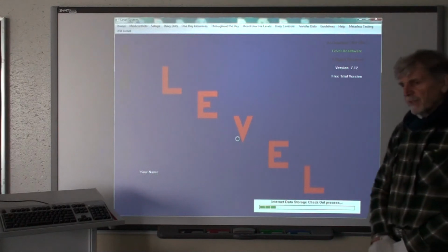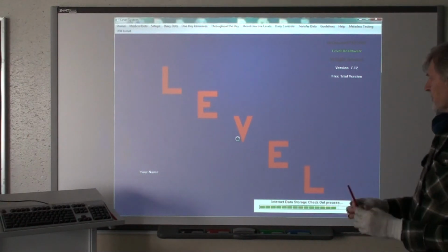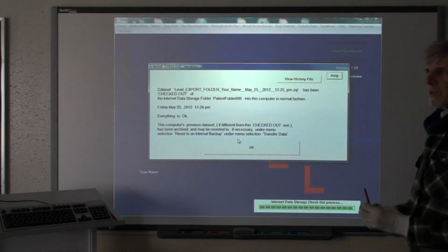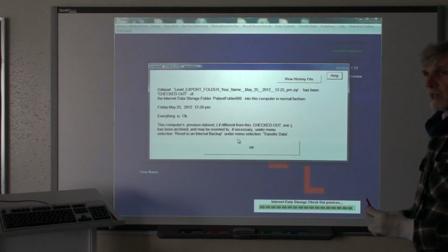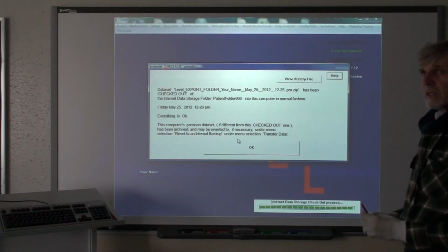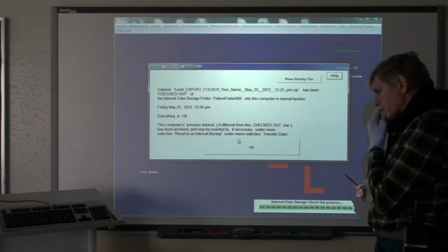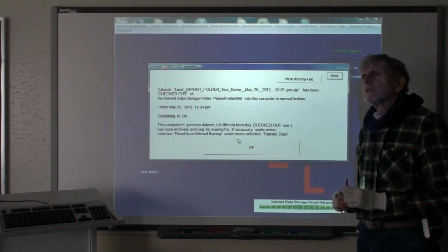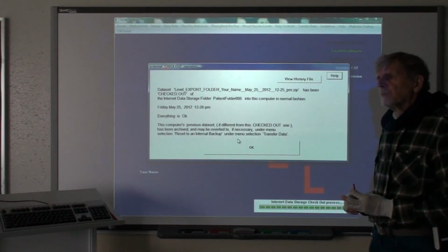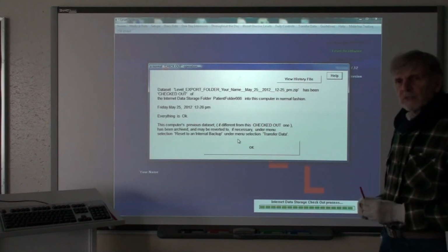However, level is fairly intelligent. If it notices that no other computer has placed a data set on top of yours at that location, then it is needless for it to actually copy it back in, since it's synchronized and duplicated in the data set in this computer.